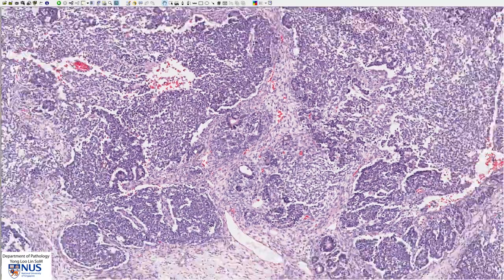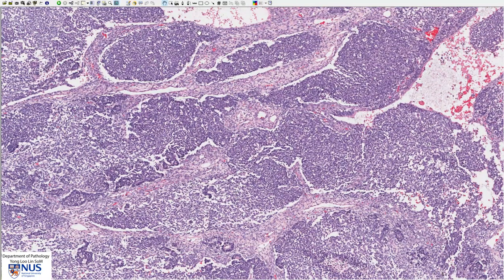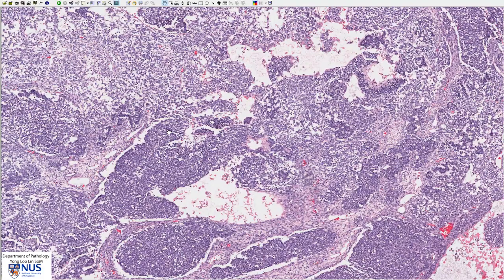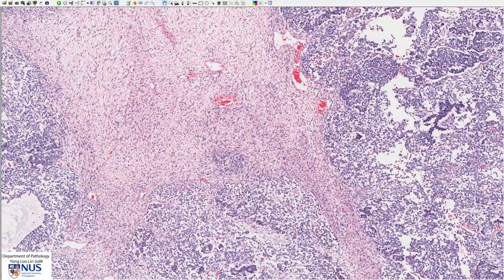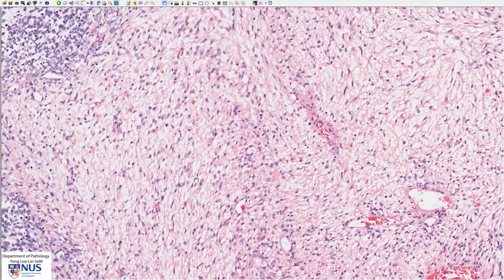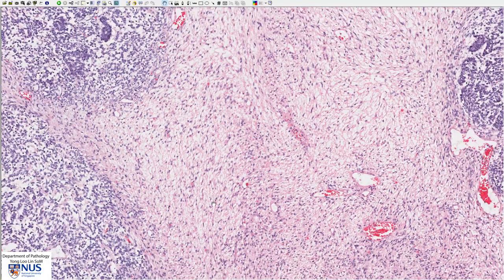The third component is the stromal component, and that is composed predominantly of spindle cells. As I navigate around to look for the stromal component, we can see these very large nodular sheets of blastemal cells. The stromal component is seen nicely in this area — it is composed of cells with oval or very elongated slender spindle nuclei, and it can vary from hypocellular to hypercellular. Sometimes we can also see heterologous stromal components, such as adipose tissue or cartilage.